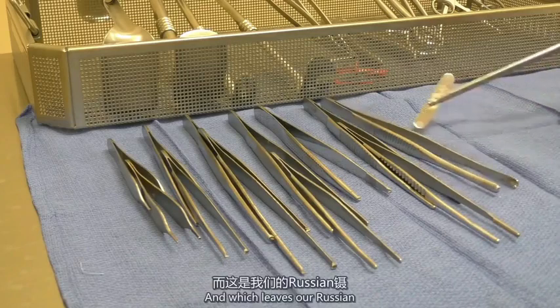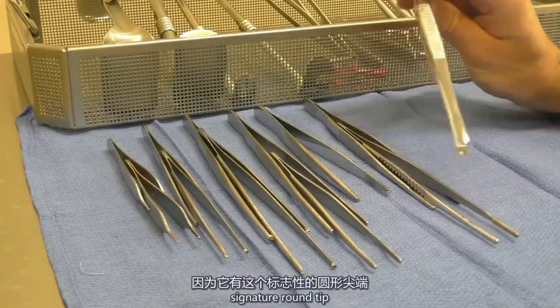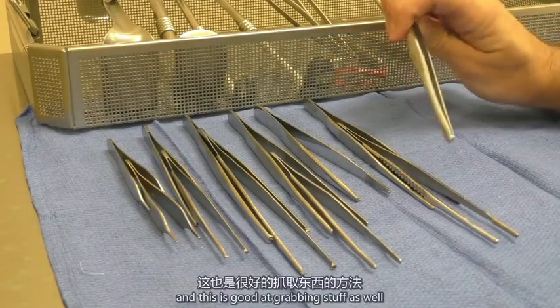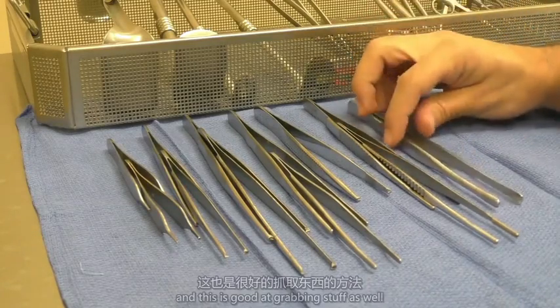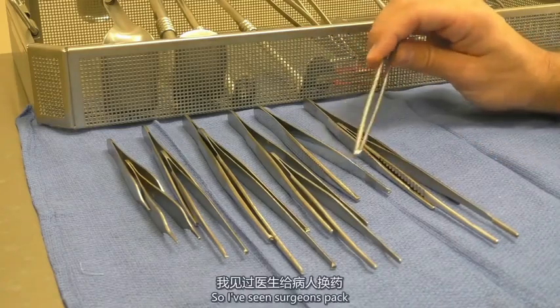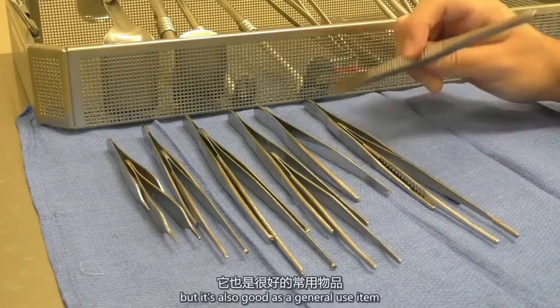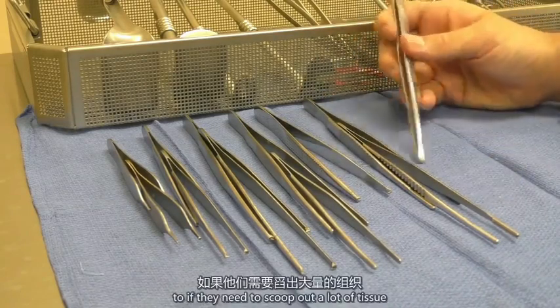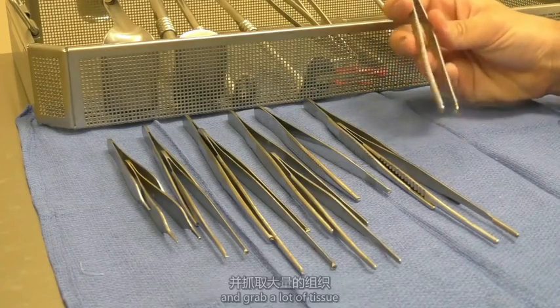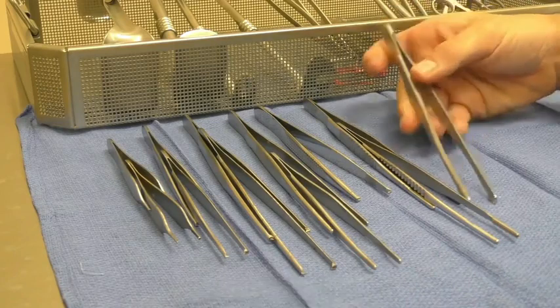And which leaves our Russian forceps at the end. It has this signature round tip, and this is good at grabbing stuff as well. I've seen surgeons pack wounds with dressings with the Russian, but it's also good as a general use item if they need to scoop out a lot of tissue and grab a lot of tissue for specimen or something like that.